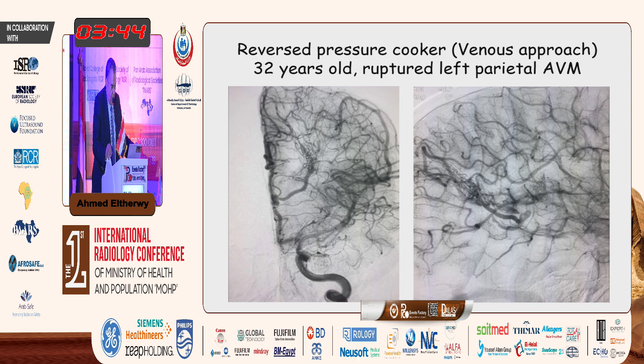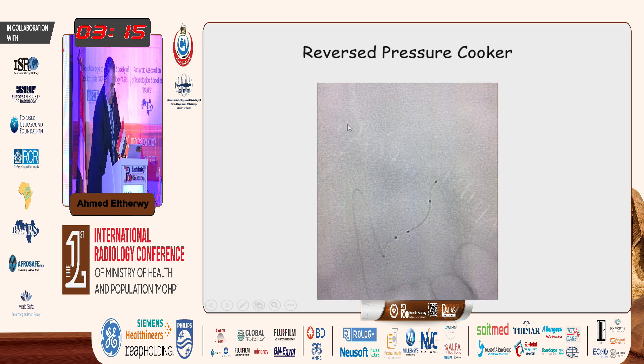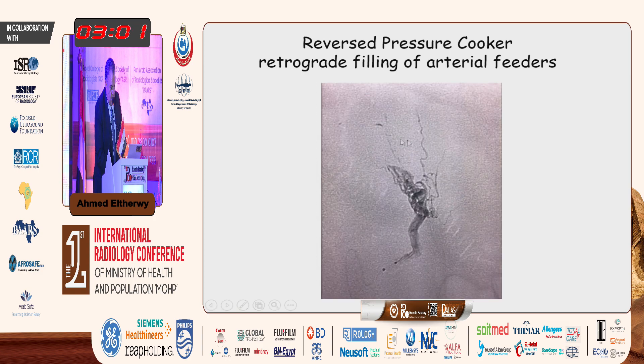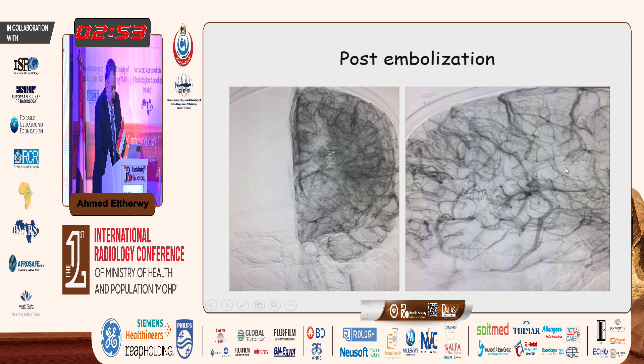This is a 32-year-old with a ruptured left parietal AVM. As we can see, this is the arteriovenous malformation — you do not see a feeding artery going to it; it's all on-passage supply. This is the draining vein on the lateral view going to the deep system. So we go through a jugular approach with an 8 French guiding catheter placed in the straight sinus, then navigating two micro catheters — the Sonic and the Magic — in the deep system until we reach the foot of the vein. Here are the four markers of the catheters. We inject some onyx and then glue, then start pushing the onyx retrogradely into the arterial feeders from the venous side to the arterial side, obtaining a complete cure through a venous approach.